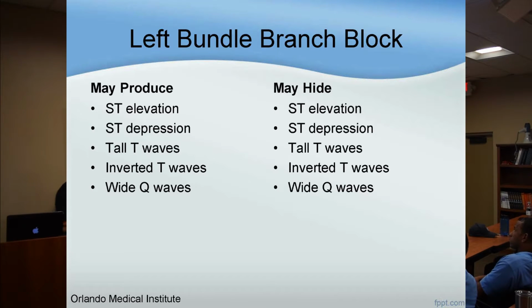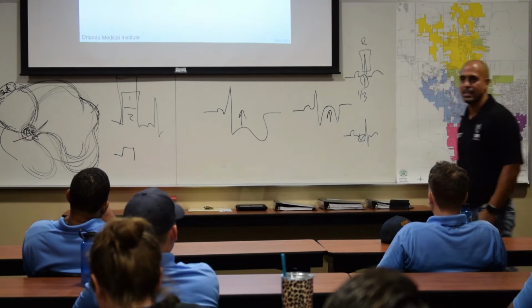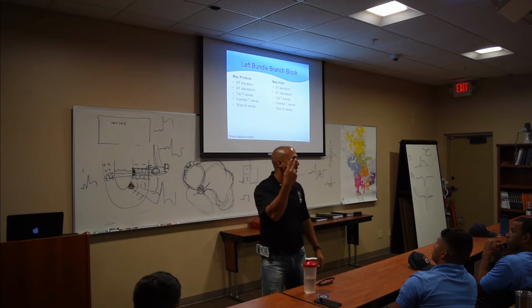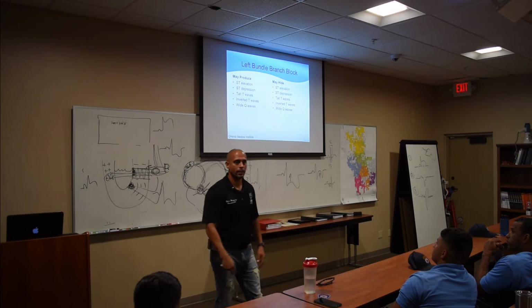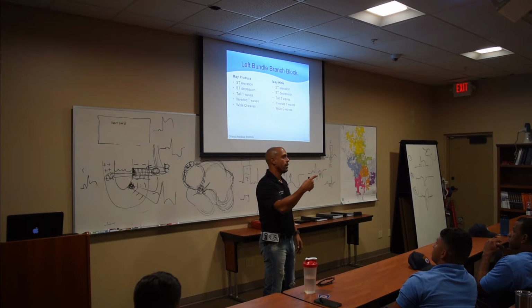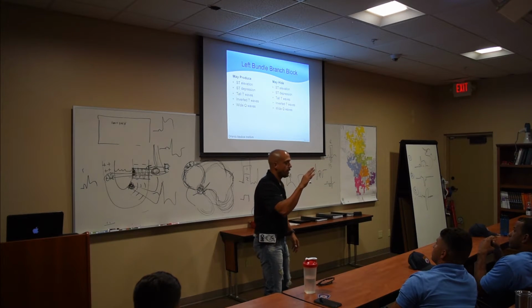So, you know what? It may produce ST elevation, may produce ST depression, may produce a tall T wave, may invert a T wave, have a wide QRS. It may hide ST elevation, may hide ST depression. They're the same thing. So what am I trying to tell you in this slide? Don't bank on looking for ST elevation in left bundle branch block. Get the history, look for Dr. Sgarbossa's criteria, or if it's a new onset, no brainer.